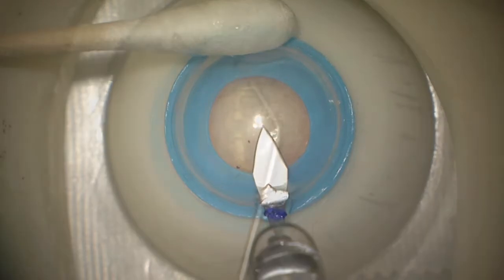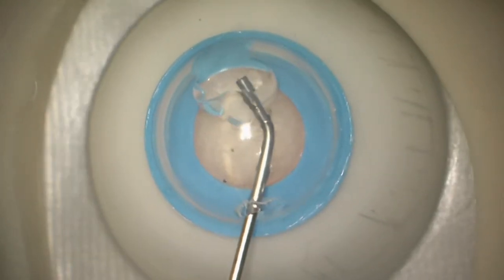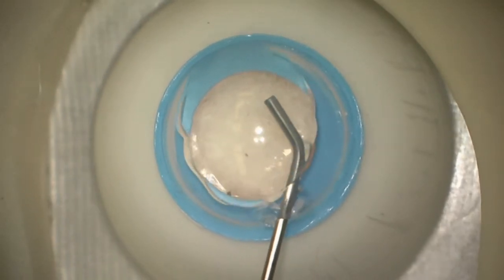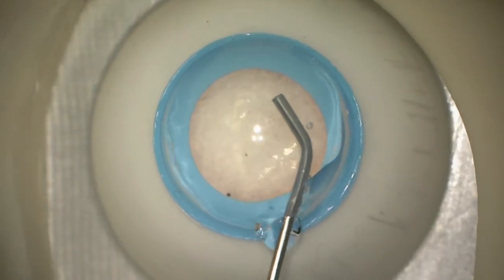You can see they make a decent simulation of the incision. We're placing some viscoelastic in the anterior chamber — a very nice simulation of that. We can make a paracentesis as usual.